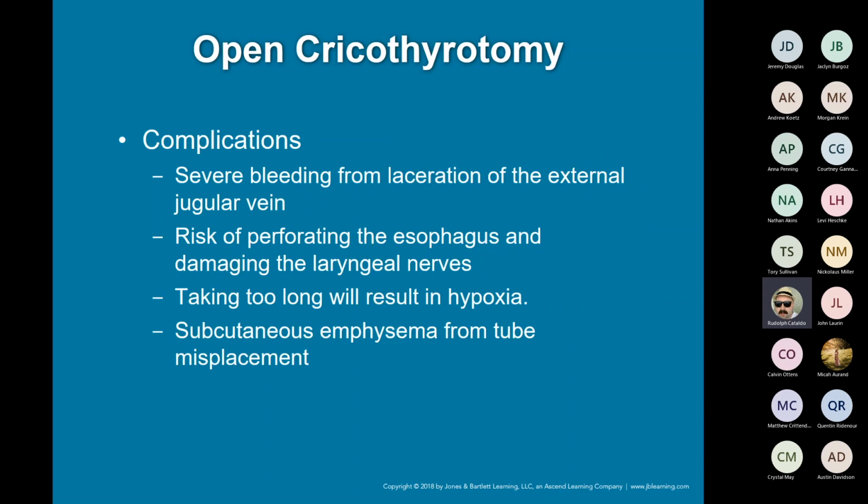The reason they say an open crike is a lot more difficult than a needle crike is because a needle crike is a very small needle. I wouldn't say small needle, but it's smaller than a scalpel. It's smaller than a quick crike. So it's a lot easier for me to put that small object into the small opening, as opposed to putting a larger object into a larger opening.